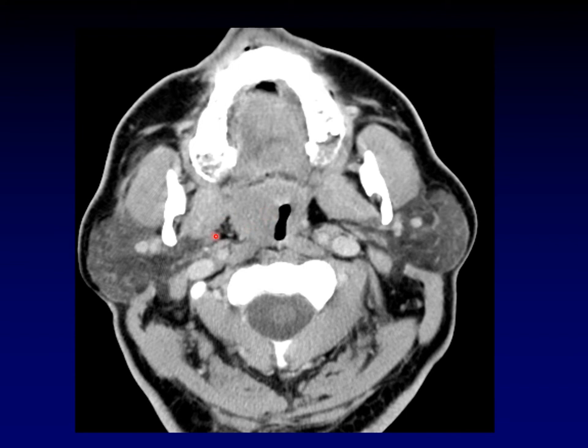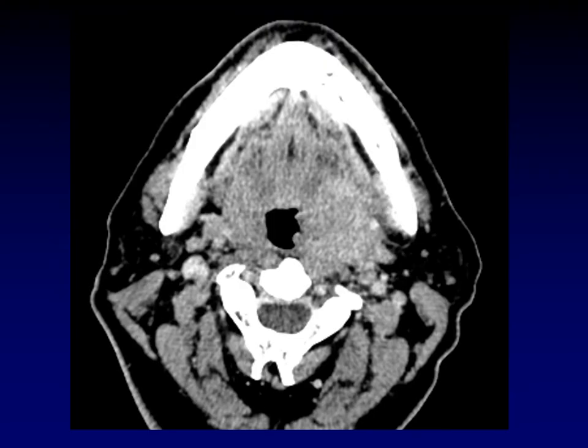Again, note the relationship to the parapharyngeal fat — it's pushing it out laterally. Now here is a tricky case: a uniformly enhancing mass within the tonsil itself, but this is squamous cell carcinoma. It's important to remember that an uncommon presentation of a common disease is more common than the characteristic appearance of an uncommon disease. Squamous cell carcinoma must be on your differential when dealing with a tumor in the lateral pharyngeal space, even if it looks like a lymphoma, because squamous cell carcinomas are so much more common.